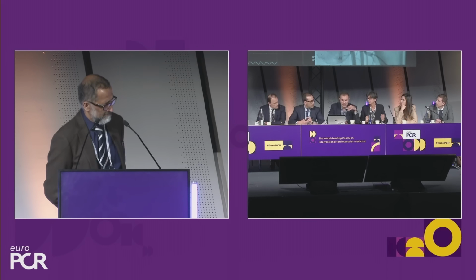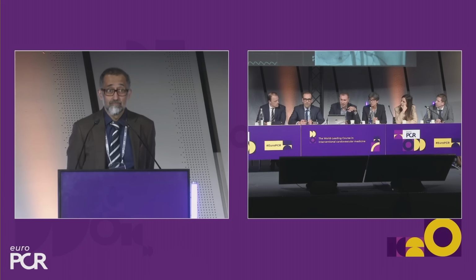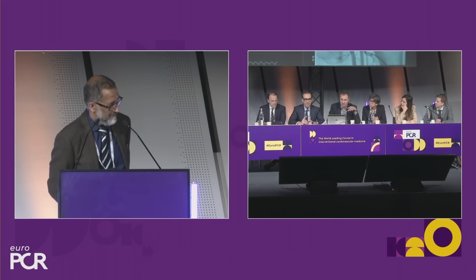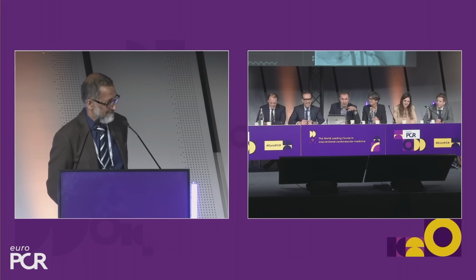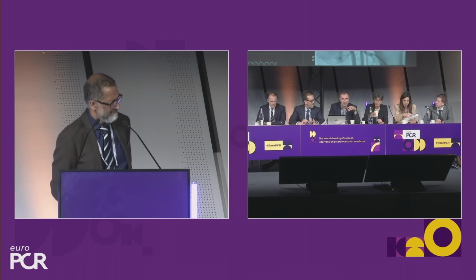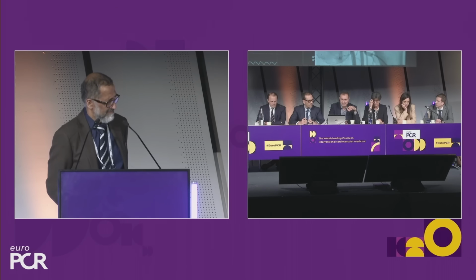And I think the advantage of that is that the incidence of needing to post-dilate is much less because of inadequate expansion. Just to change the topic slightly, there was a question that I thought we had covered earlier on, which is why have we concluded balloon expandable was a better option? But I think we concluded that self-expanding was a better option than balloon expandable. And the reasons are, it's a small annulus, you probably get a better EOA, better hemodynamics, and because of the age, we want a valve which has good subsequent coronary access, and Navitor lends itself very nicely to that.